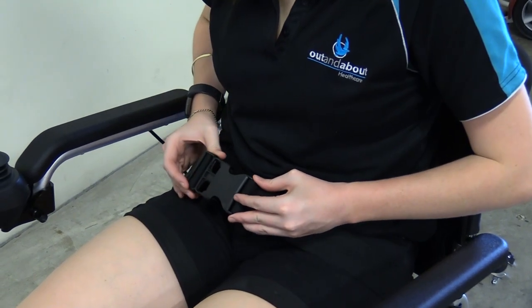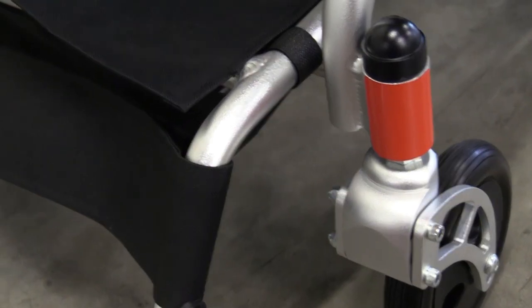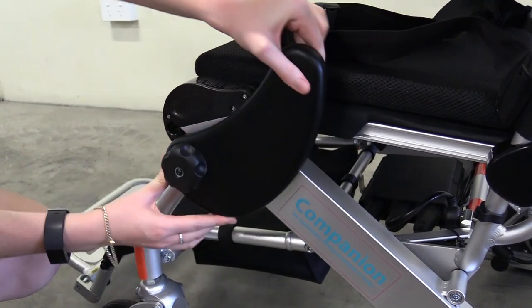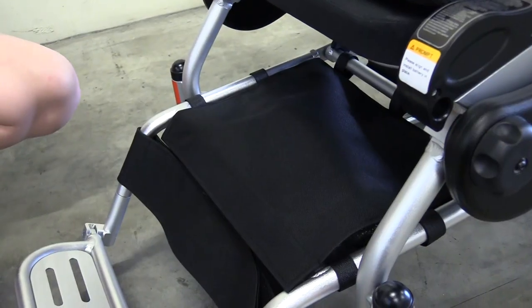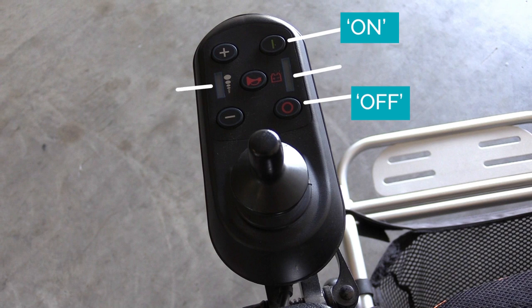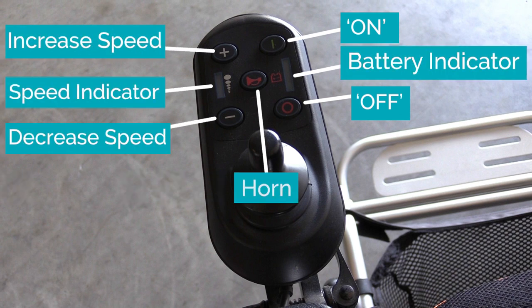Your wheelchair is equipped with a number of features, including an adjustable seatbelt, reflective markers, leg guards, and a storage basket. Your control panel has a simple layout including your on and off buttons, battery and speed indicator, speed increase and decrease buttons, and a horn.